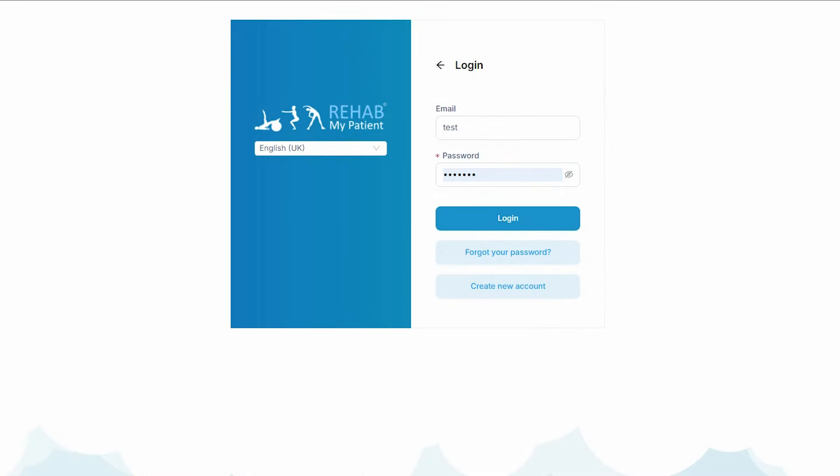Welcome to Rehab My Patient. Sometimes practitioners email us and say how fast is Rehab My Patient — we just want software that allows us to prescribe exercise plans quickly. Well, let's go through it.